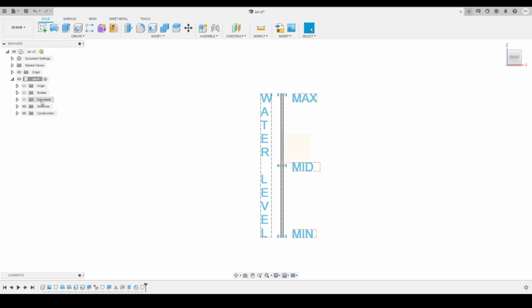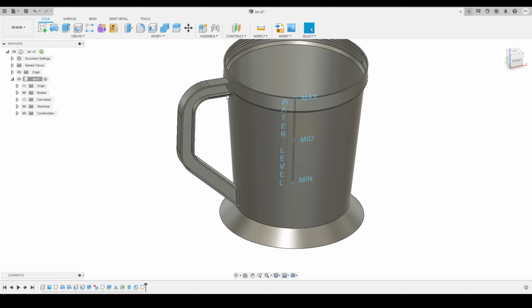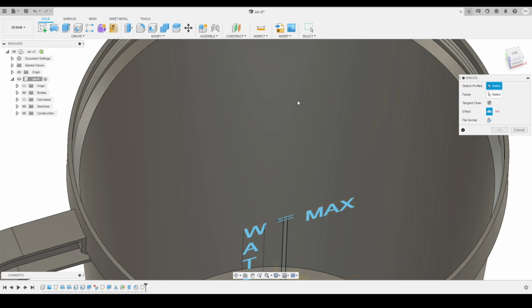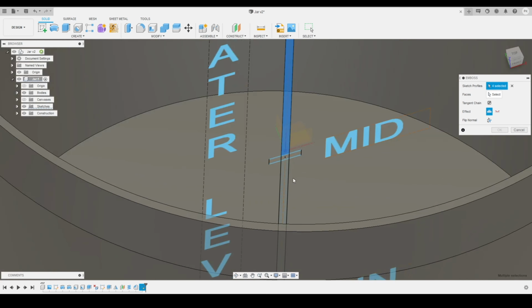I will click on finish sketch, then we'll turn on the body. So here you can see these are the previews we are getting. So we'll go into the create tool. Now we'll activate our emboss tool from here. Here you can see I will select the profiles that I want to emboss. So these are all the closed profiles that I want to emboss, so I will select all the profiles. Here you can see these are all the profiles that I want to emboss.